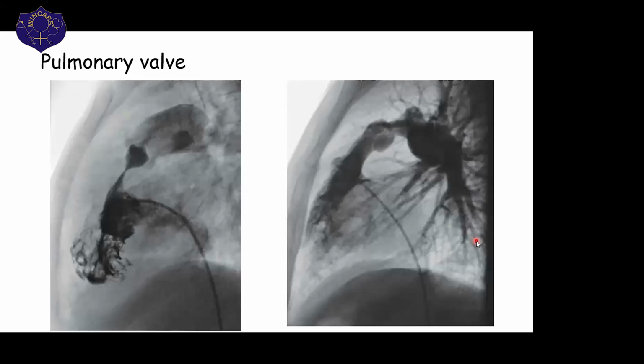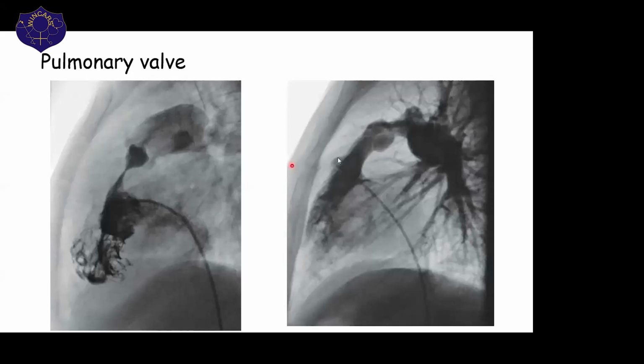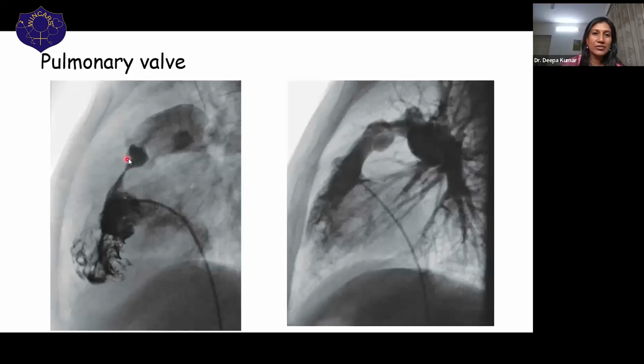One person actually said infundibular. Yes, probably the first one is correct. But other ones are saying no significant post-stenotic dilatation, and someone said the pulmonary valve, I think dysplastic is what they wrote. Yeah, okay, that's good. So you're correct. It is a severe infundibular stenosis.